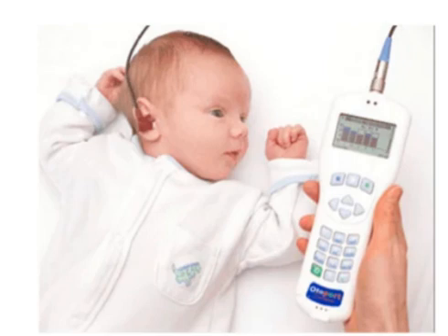Studies have shown a stimulus level of 55 to 65 decibels SPL intensity, a 10 decibels SPL difference between the two tones, a frequency range between 2000 Hz and 8000 Hz, and a frequency ratio, F2/F1, of 1.2 provides the best accuracy in separating normal hearing patients from those with hearing loss.